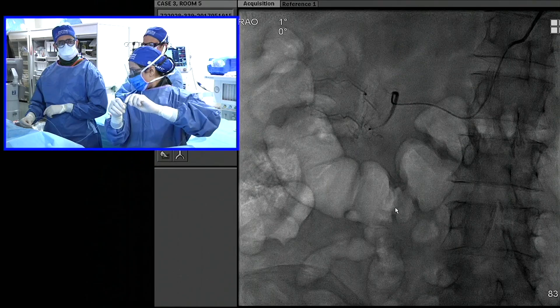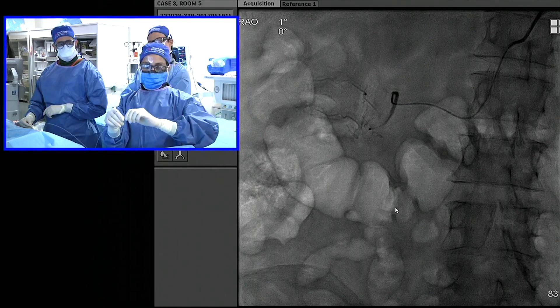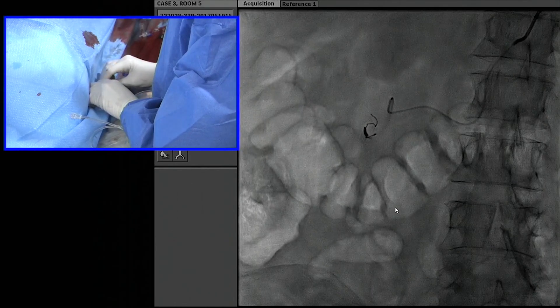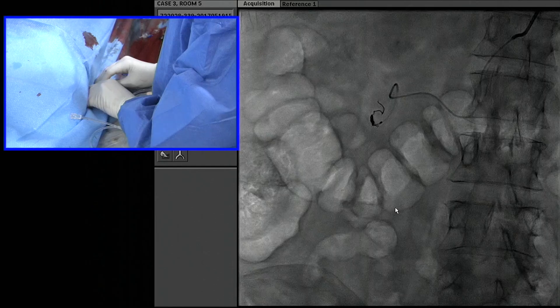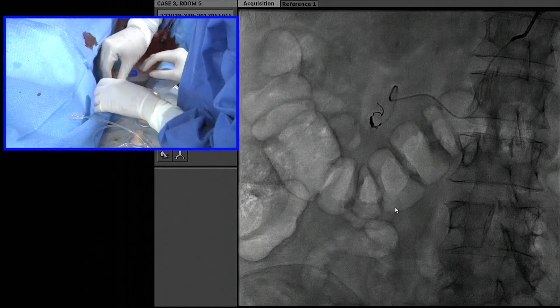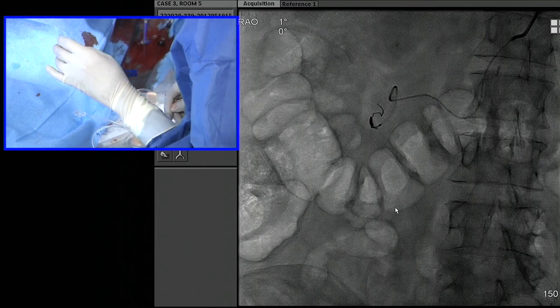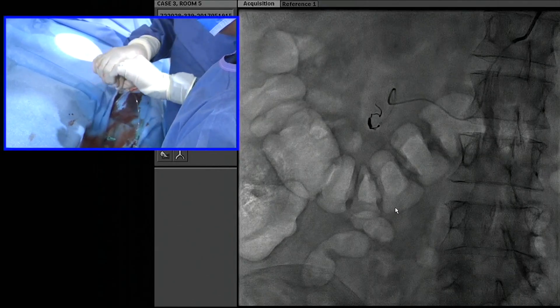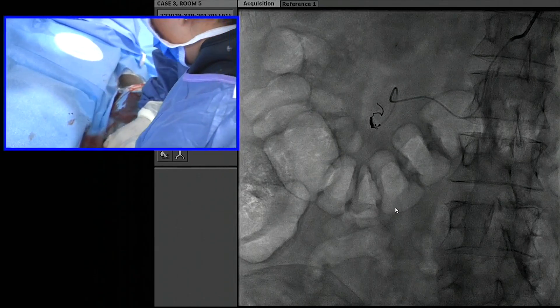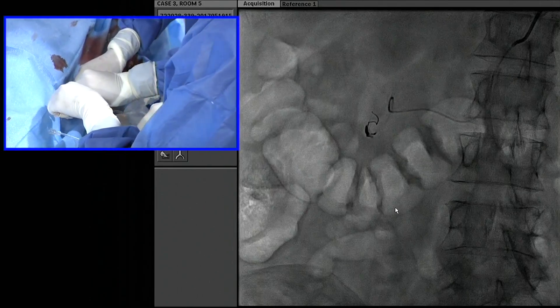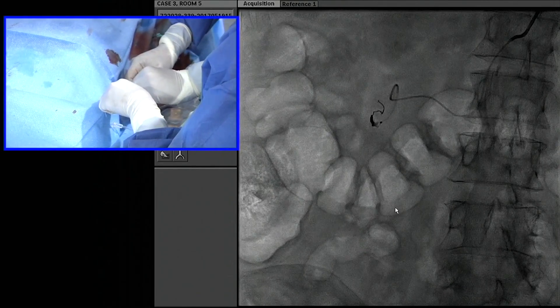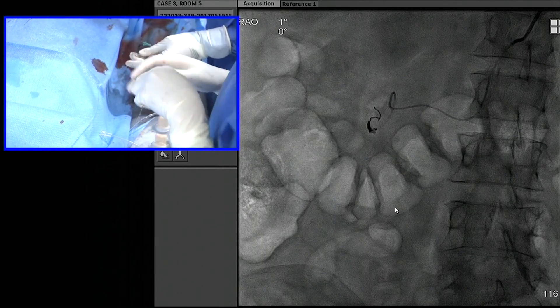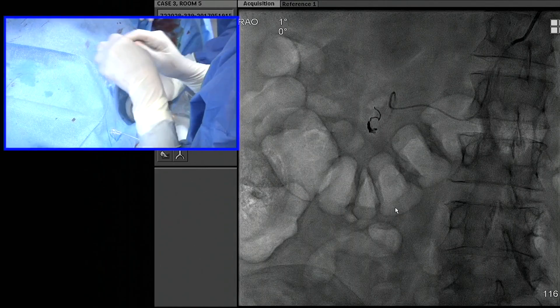Here's the Concerto coil — it's nice and soft, fibered, and short. They'll go through a low-flow microcatheter. We're at a spot where it looks like the last loop is sort of half in, half out of the vessel. So we're going to detach part of it while still slightly inside the microcatheter and then puff it in — I find that when you do this, it sort of just flies in. Dr. Ranade just did a manual detachment without the detachment device, which is probably not what most people should do if they haven't used this product. Basically, I detached it and then used the pusher to push it back in out of that last little loop.